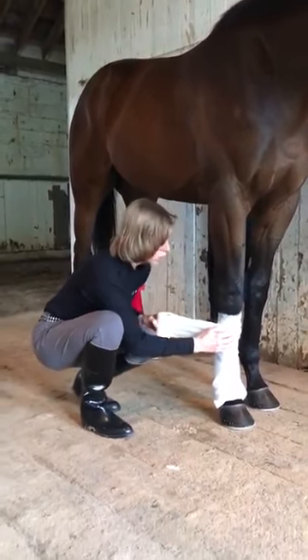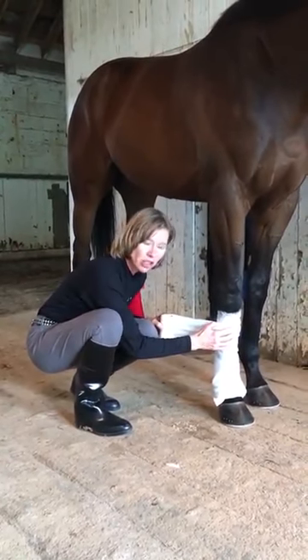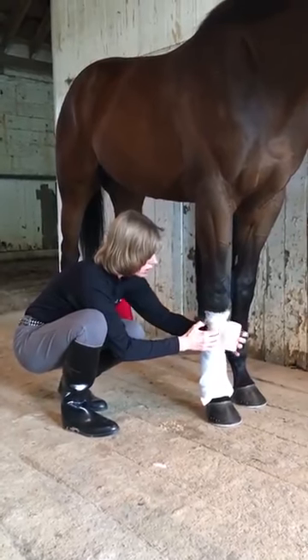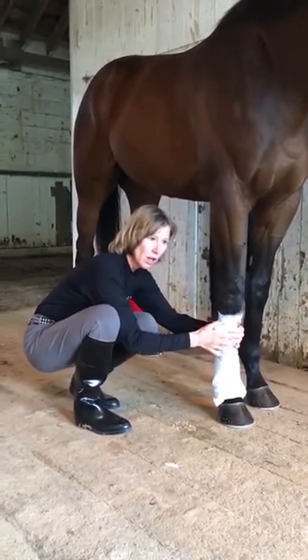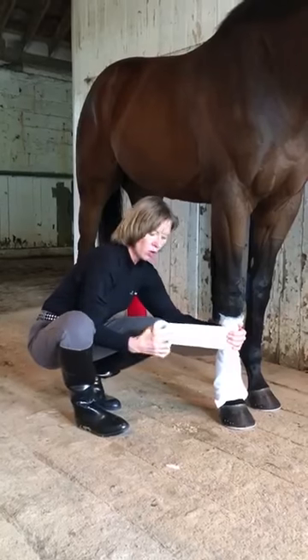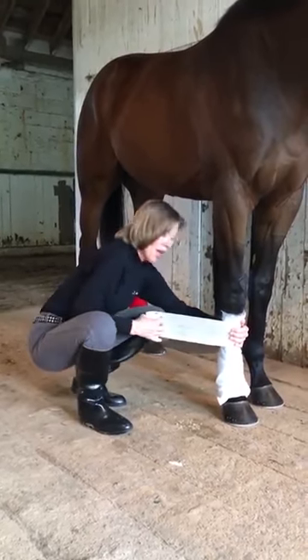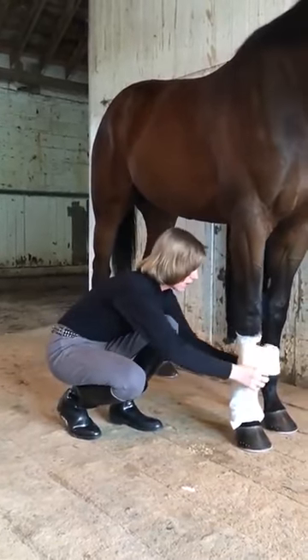You pull when the tension is around the cannon bone — pull the vet wrap, go around, get to the other side, and hold it with this hand. With the opposite hand, pull some out and then pull it tight again. Not really, really tight, but just stretch it out a little bit, and then go around again.